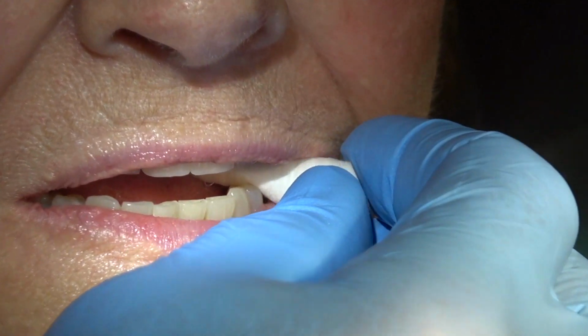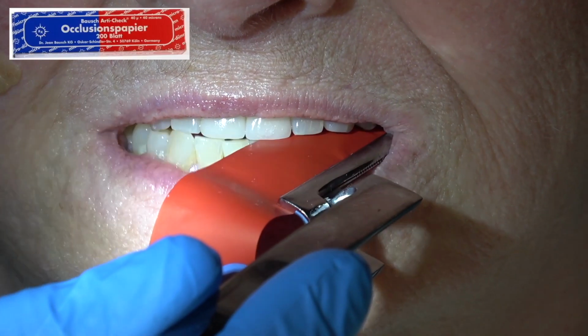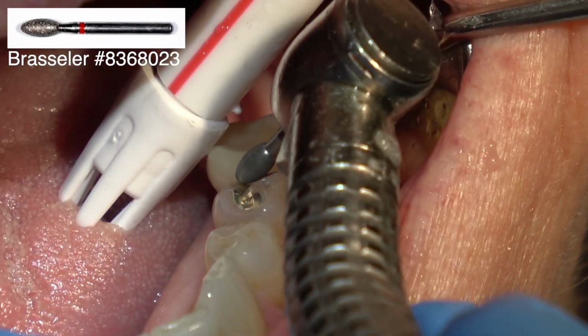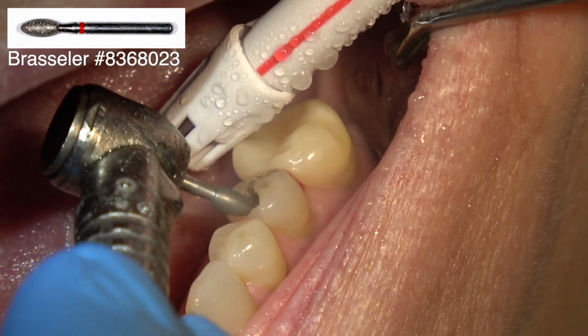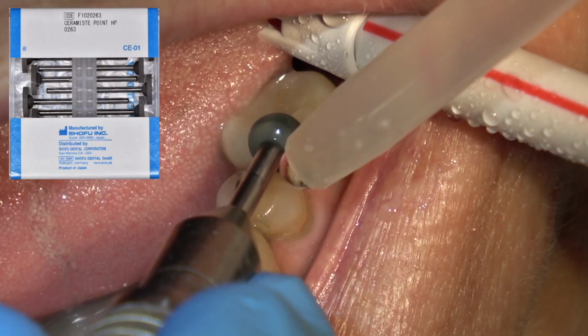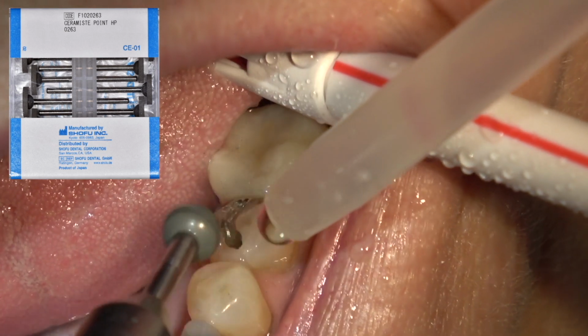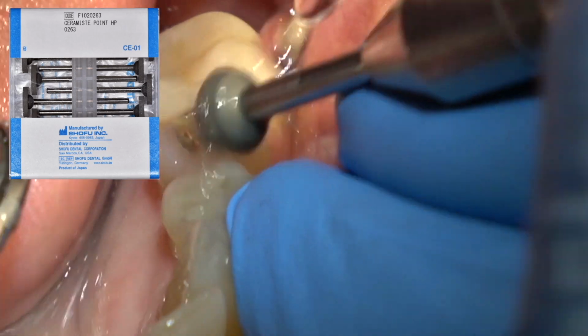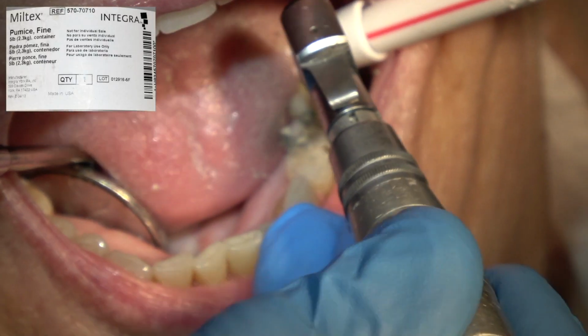Have the patient bite firmly. Check the occlusion. Then I'm going to polish the margins with this football diamond, or you can use a fine chamfer diamond. And then I'm going to come back with Shofu rubber wheel and polish from the restoration to the tooth. And then I'm going to finish with pumice in water.